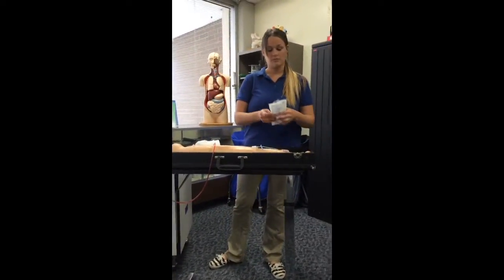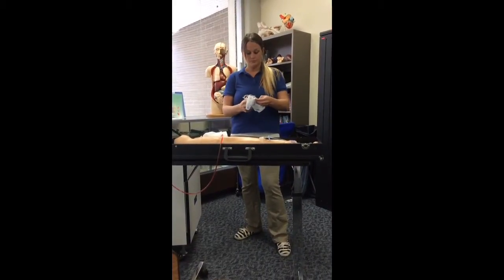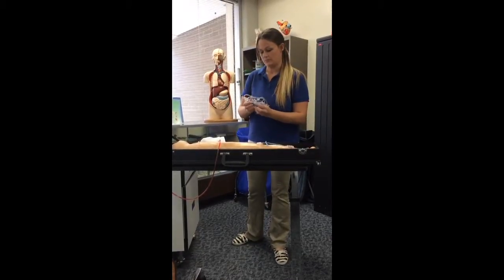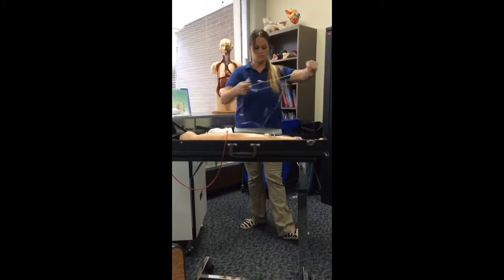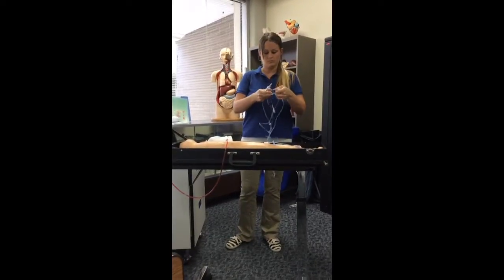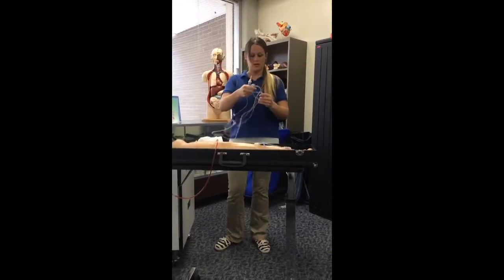I'm going to take my prime tubing. And normally it wouldn't be this tangled.